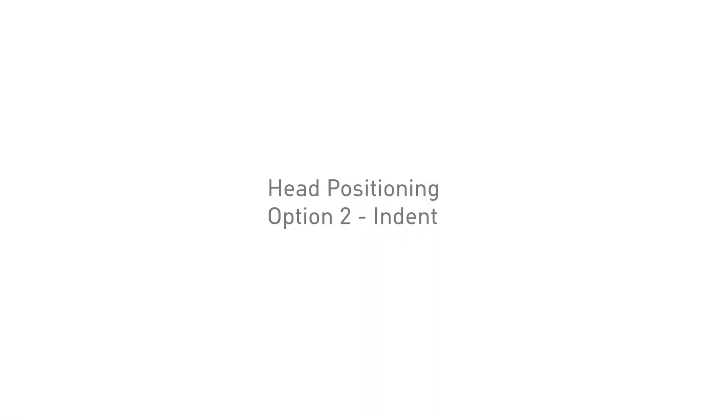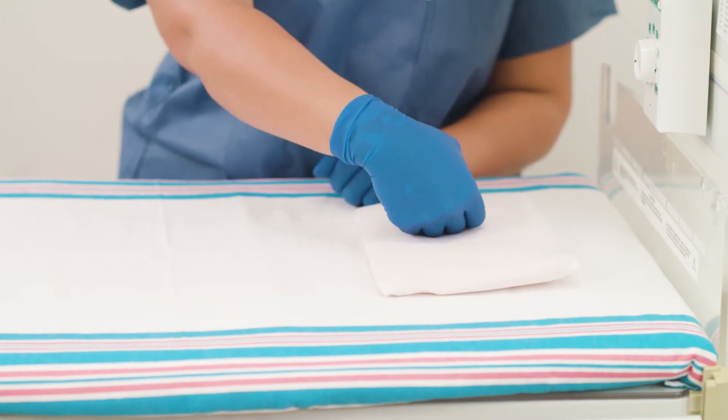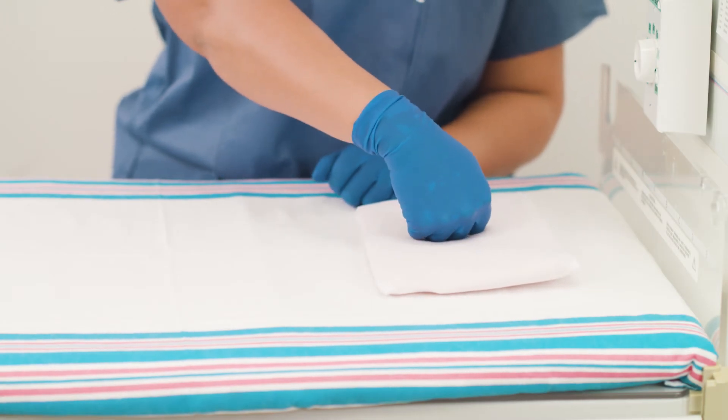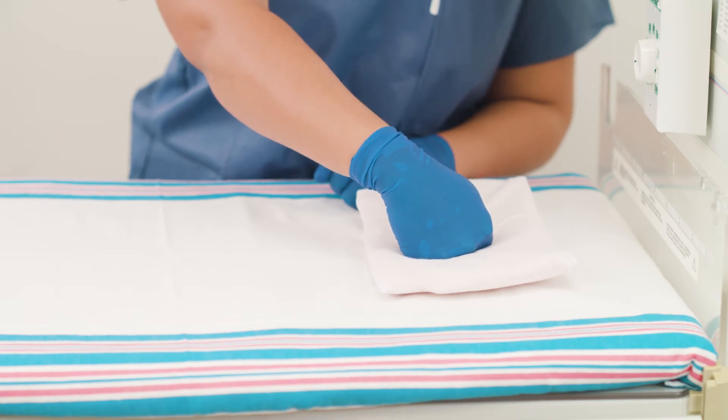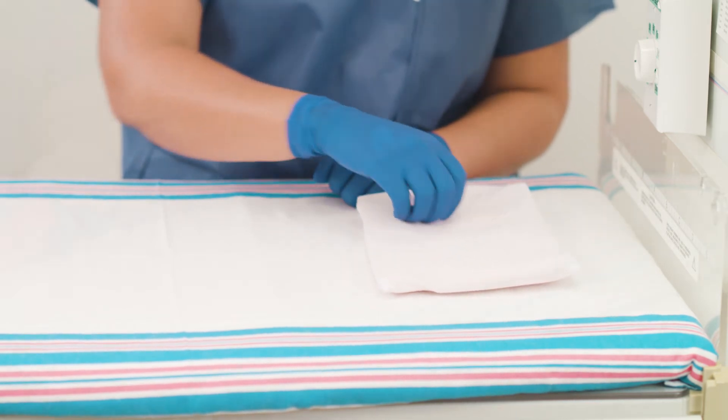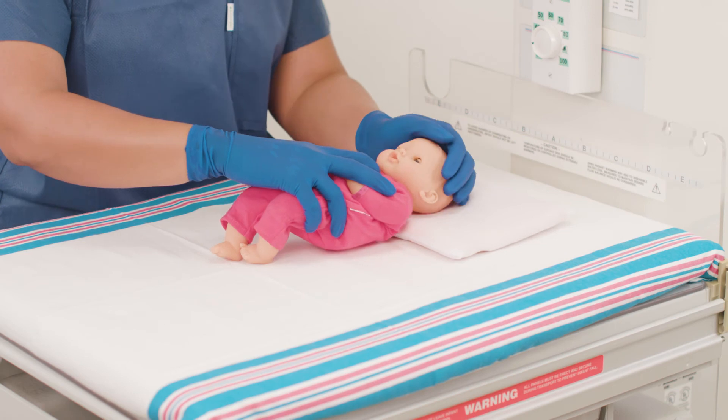Option two: creating an indent on the positioner. Begin with the positioner flat and inside the cover. Using the fist, create a small divot for the baby's head. Ensure the positioner does not bottom out in the divot region. Place the baby on the positioner.